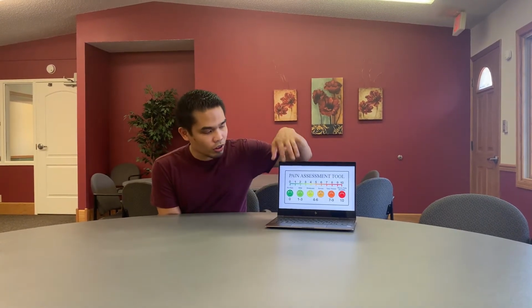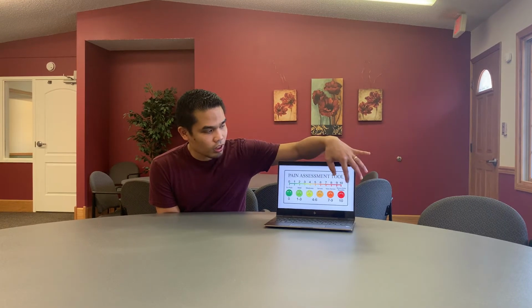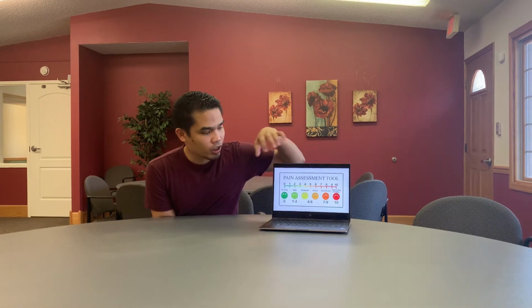When they come in the PFT room, we would always take their height and weight, and also obtain the pre-assessment vital signs such as the heart rate, respirations, blood pressure, and SpO2. I would also take the pain assessment tool or the pain score. The reason I include this is I would like to know if the patient is exhibiting any pain currently, which may affect their performance.